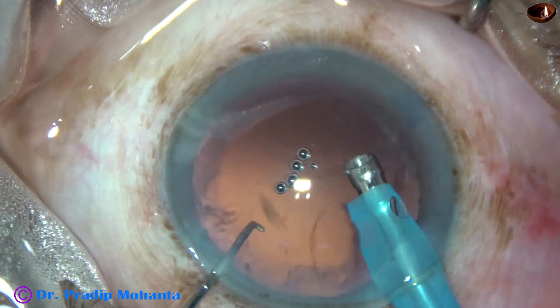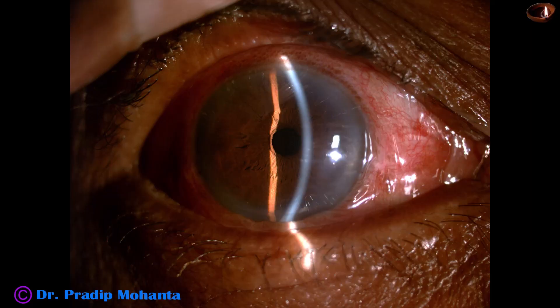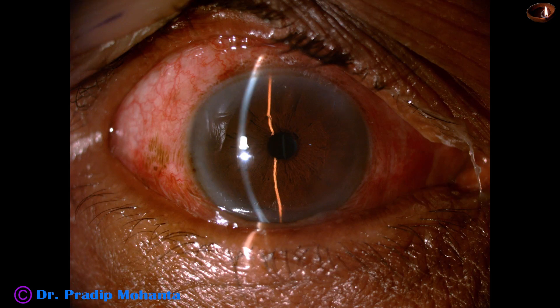Cortical cleanup is done and an intraocular lens is implanted. Now see the post-op pictures just after 18 hours: crystal clear cornea, anterior chamber quiet, and unaided vision is 6 by 12.